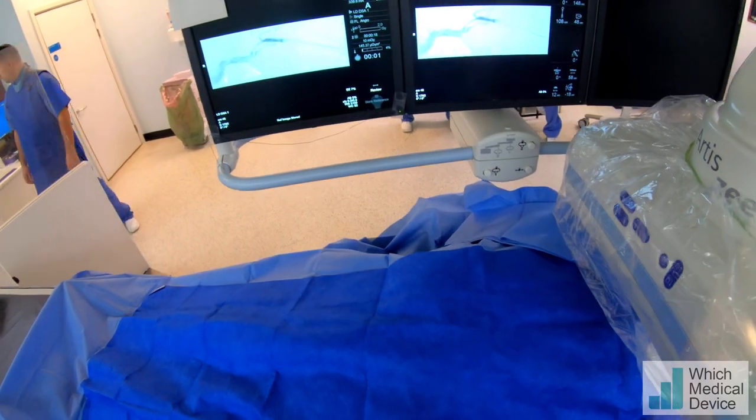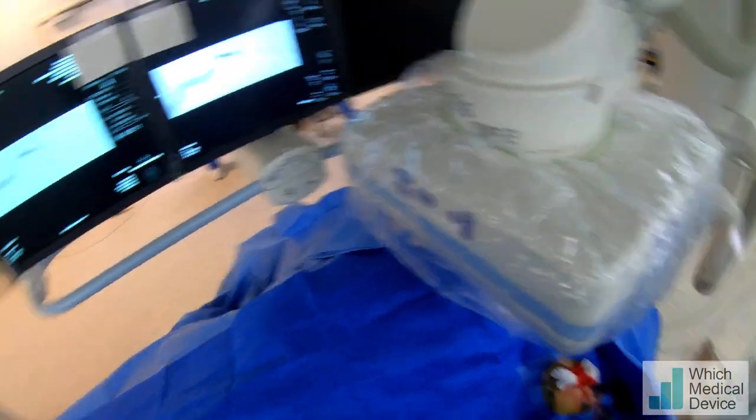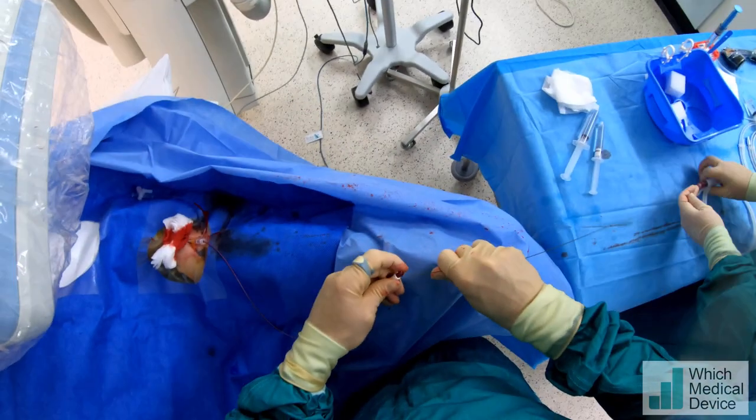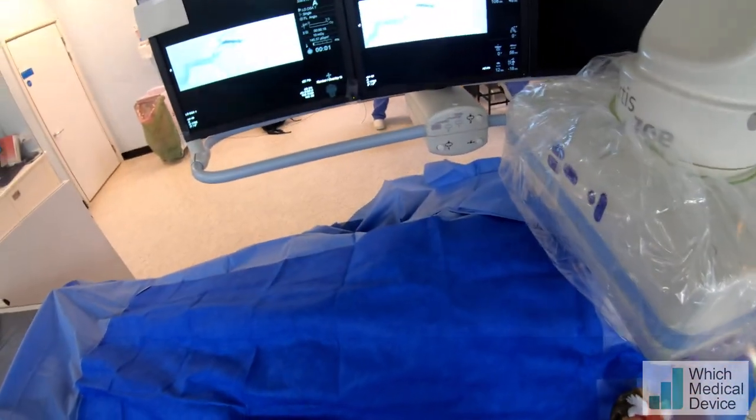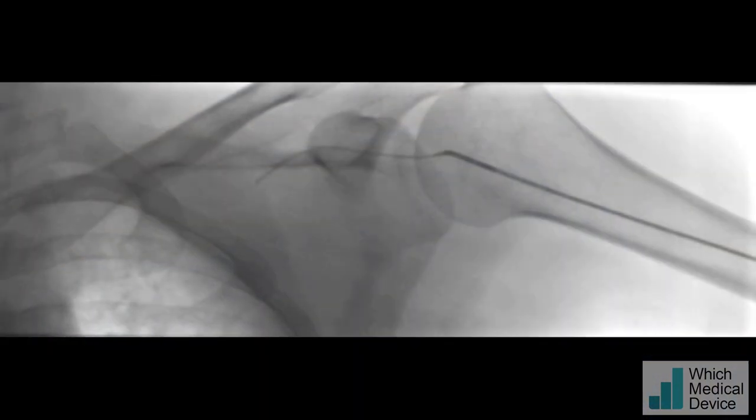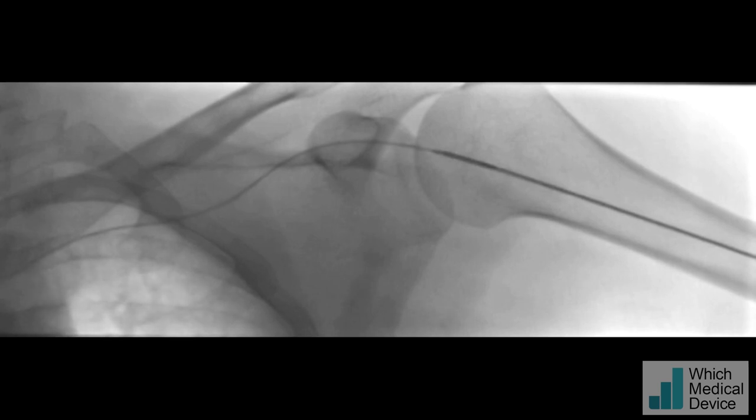So we're going to pass the Benson wire through this and round into the SVC. I suspected the Benson wire would go very easily; if it didn't, we could use an angled hydrophilic guidewire — and it's just whizzed around there now.